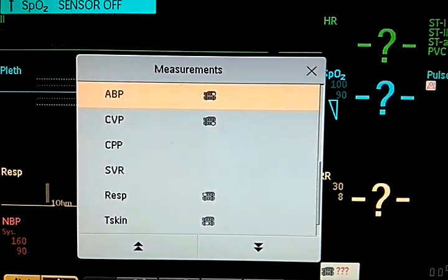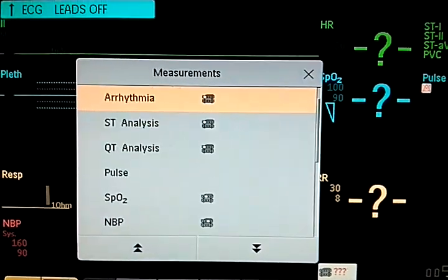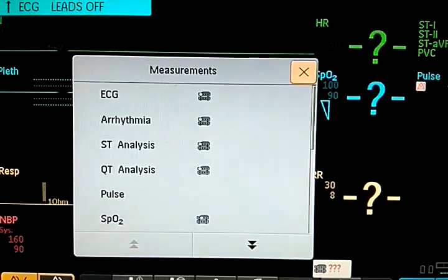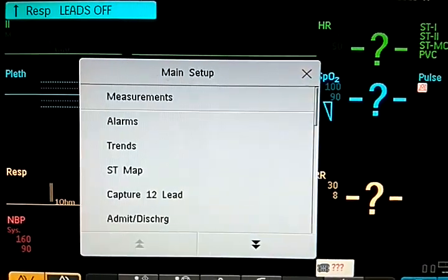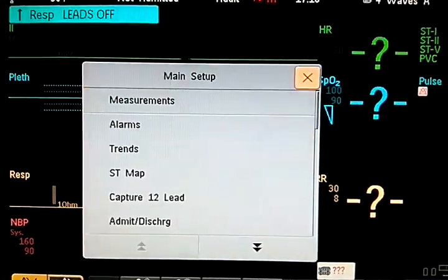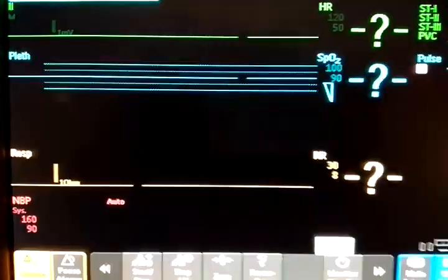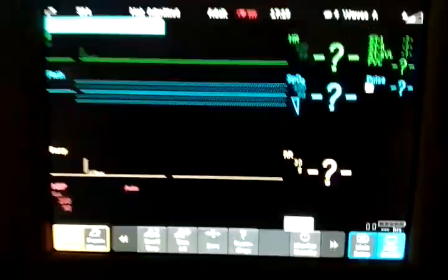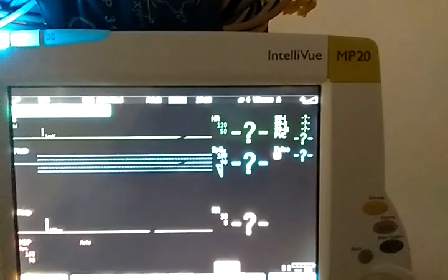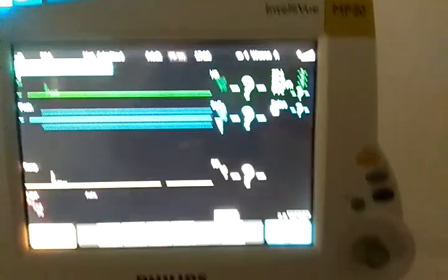That's it. So these are the setups that are in Philips Patient Monitor Philips Intelliview MP20.